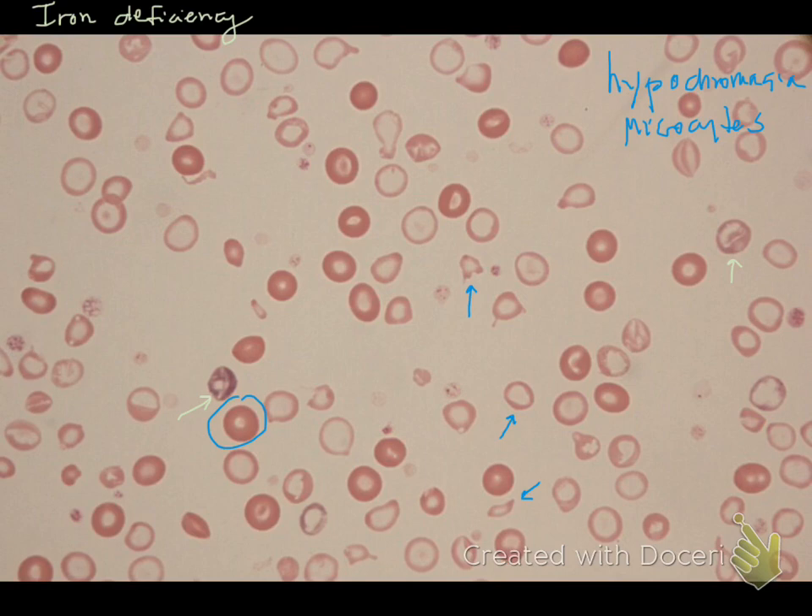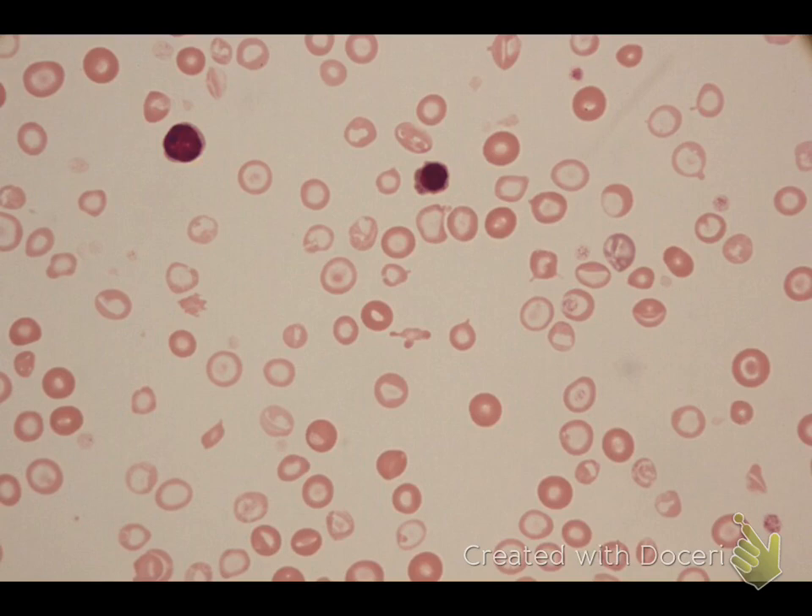So we have small cells, we have very pale cells, and then we have some shape changes. This right here has a little fragment on it — that's actually called a keratocyte, and these are just membrane abnormalities. Here's one as well — that's a schistocyte, where the red cell has been kind of ripped apart. That's an acanthocyte right here, where the red cell membrane is abnormal. These are all from the iron-poor red cells getting beat up within the blood vessels.